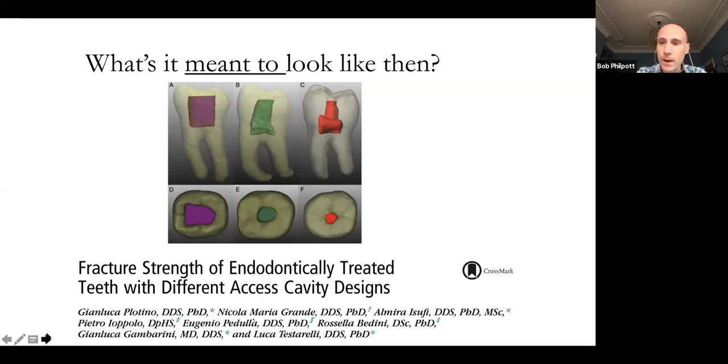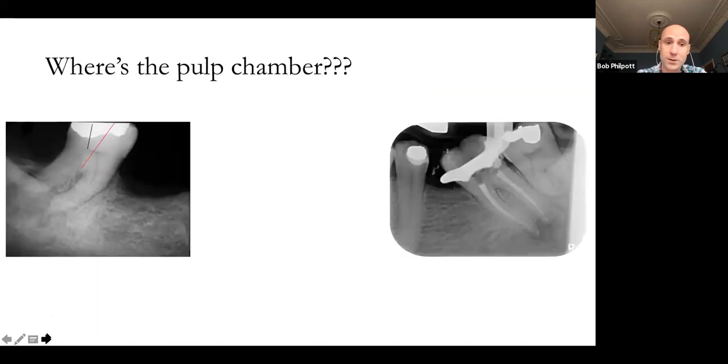And if you're doing that, you're going to end up with a satisfied dentist, a satisfied patient, even though they won't know it, and a satisfied tooth that will probably last longer. One of the key parts, and I talked about this on the second slide, is understanding that teeth are different. When you measure your distances and orientate yourself in terms of the angulation of the tooth, you understand that the access will become a little bit more complex at different points as you go through it.